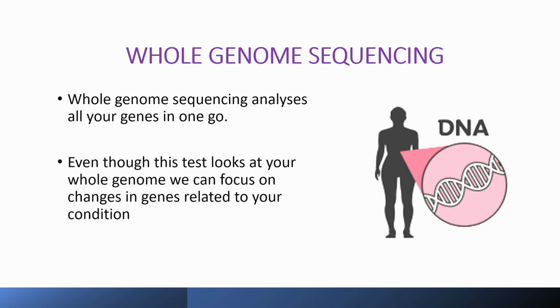including Huntington's disease, Parkinson's disease, motor neuron disease, and dementia. So for patients referred for these conditions, the whole genome sequencing analysis focuses on the group of genes which causes these disorders. So essentially, the group of genes which we'll analyse depends on what you have been referred for. So some groups of genes, which we call panels, contain a small number of genes, whereas others will contain several hundred genes, and analysis of these groups of genes will take a lot longer.